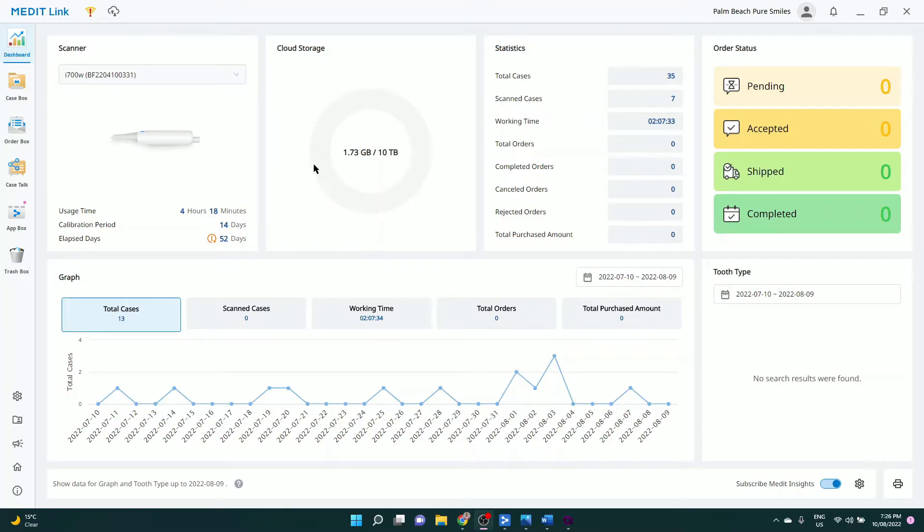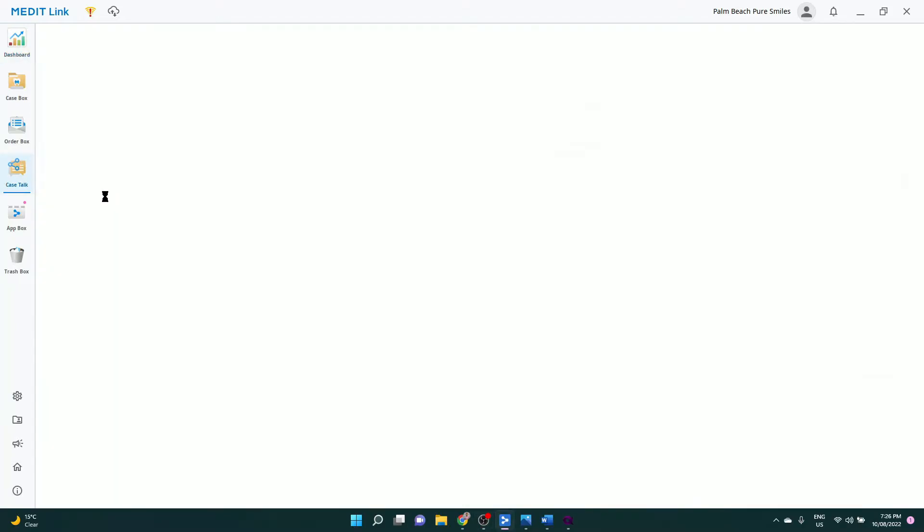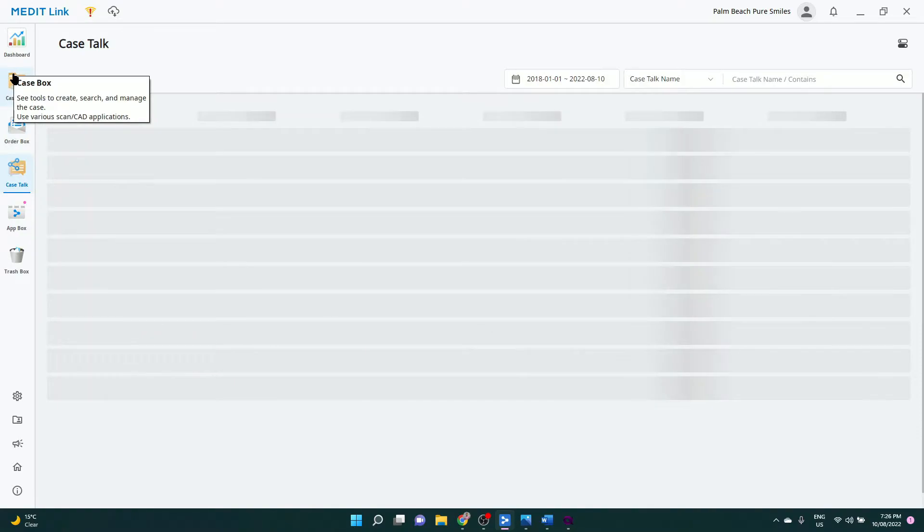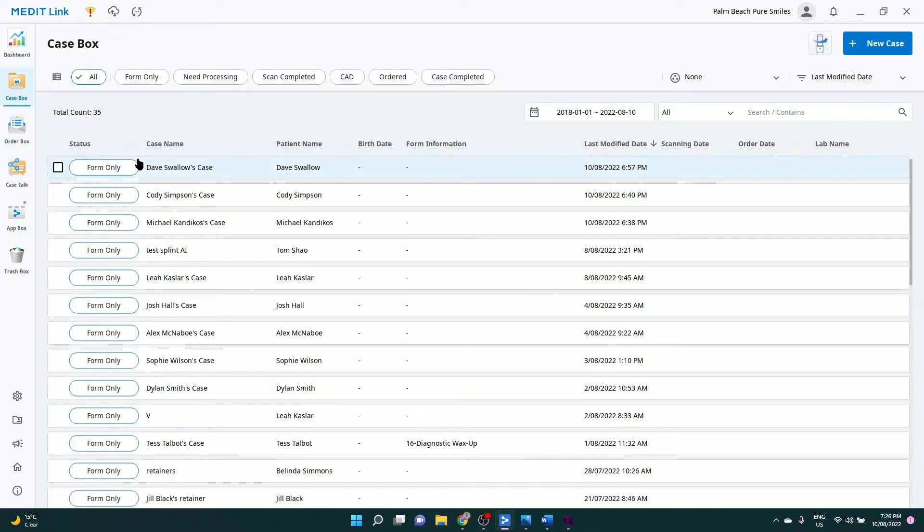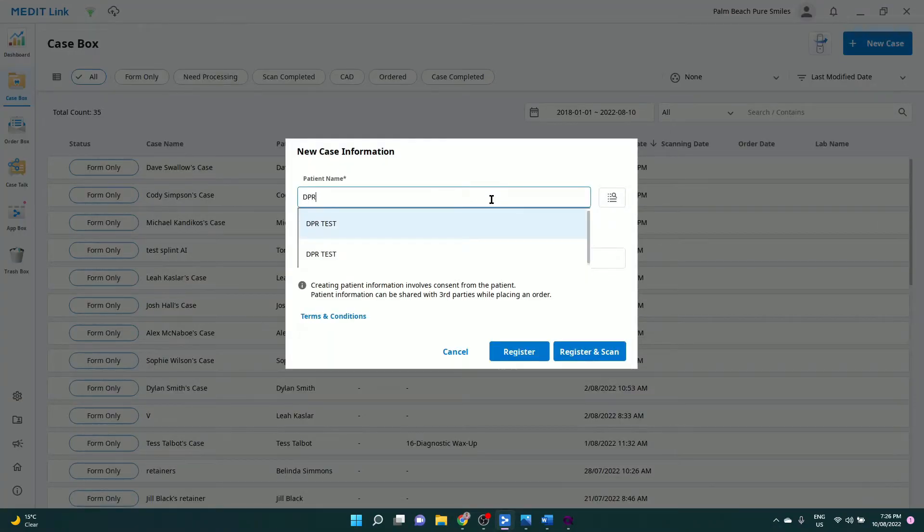I think this is a pretty significant release given how easy it is to use, and potentially it's one of the only AI design softwares that actually works in our hands. So let me show you what it looks like to start a new case.